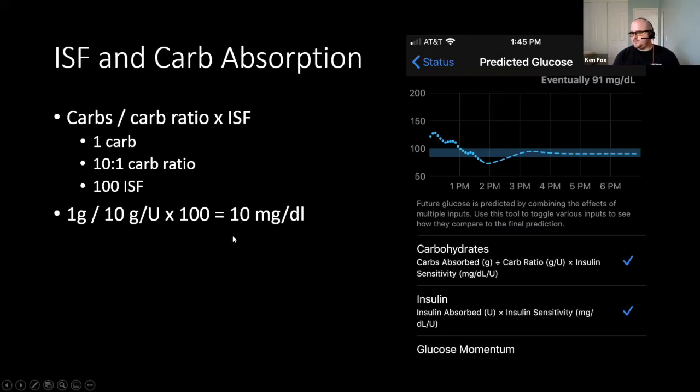So there we go. Someone else posted questions. You can set a temp. Yes, that's true. In the Ivan branch, he did add the ability to pick a temporary basal rate and actually tell it to run in open loop mode, which is super cool. That is very fun. And if you disconnect from a RileyLink, that basal will run for up to 30 minutes.